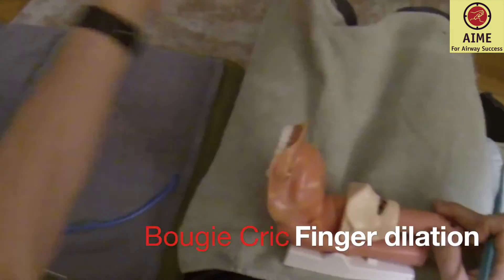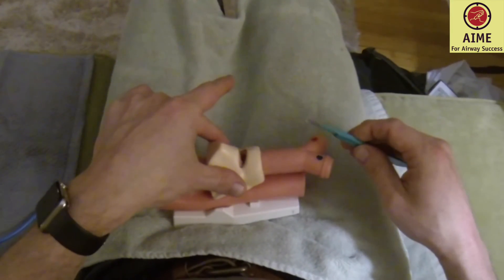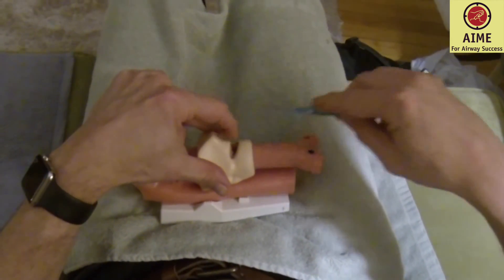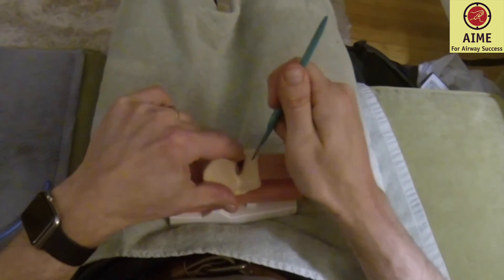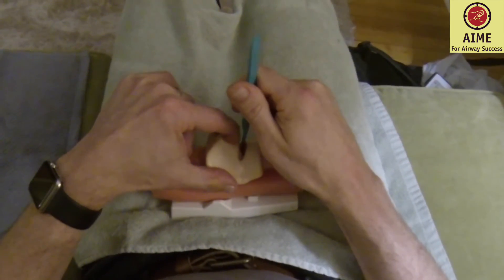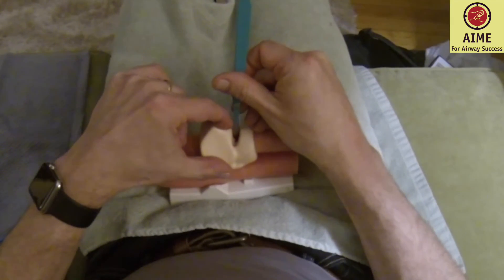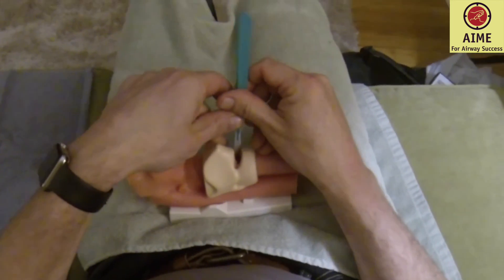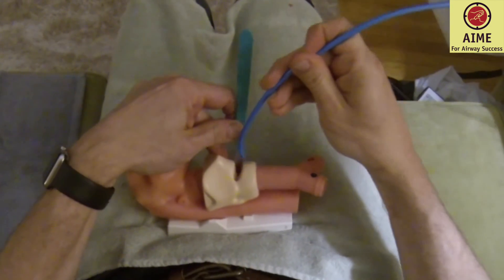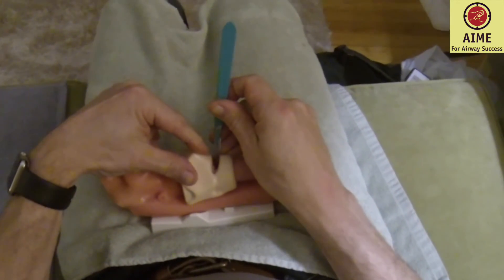Let's go over the hybrid technique one more time. Stabilize with thumb and middle finger. Index finger finds roughly where the cricothyroid membrane is. Large incision, two swipes to get down. Finger feels — that's the place. It retreats to the bottom of the thyroid cartilage. Make a stab incision through the cricothyroid membrane and extend towards you, then 180 and extend in the opposite direction. Blade goes down again, sharp end down, sweeps tissue off to the side — that gives enough room to put the bougie. If there's a problem because of blood or you just can't get the bougie alongside, at this point you can have your finger ready to go in.